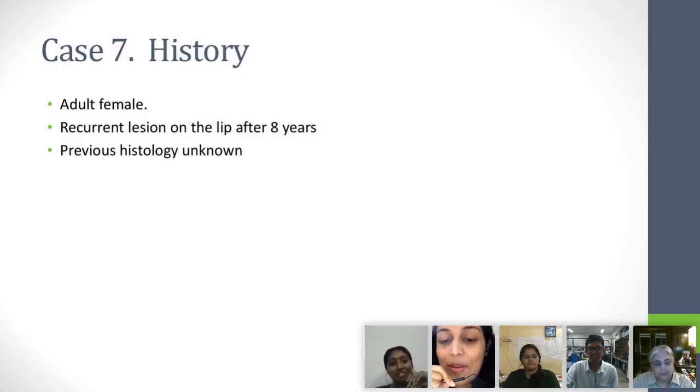You want to take this? Yes, ma'am. History says adult female, recurrent lesion on the lip after 8 years, previous histology unknown. That's the usual story in our part of the world, right? We don't know what the history was.